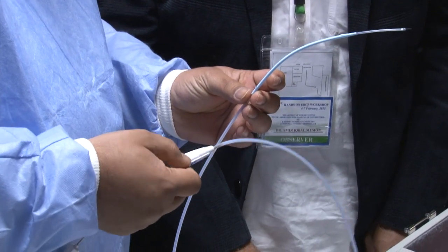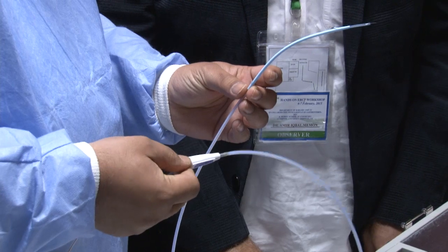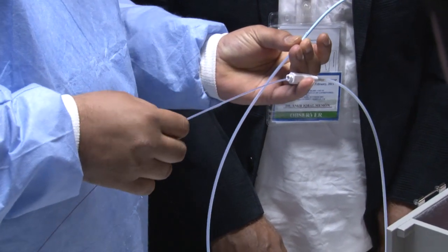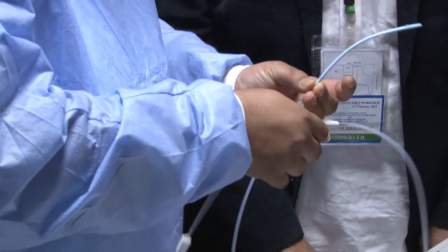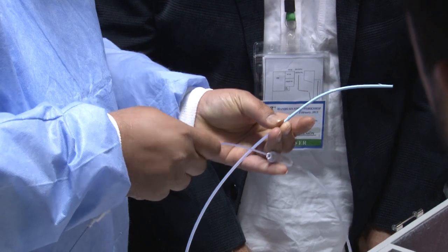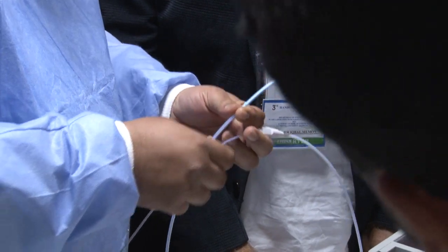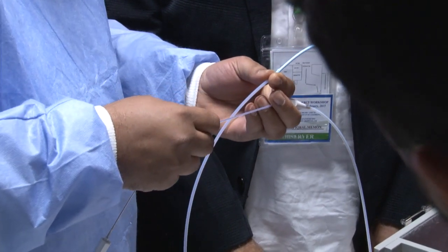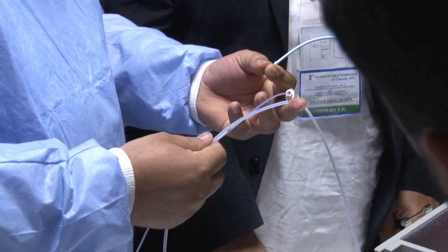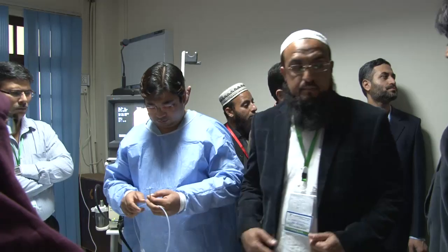But more often than not, I've spoken to a lot of people internationally also about this point. This is something that's close to my heart. And you know, you have to do a good sphincterotomy. There is no such thing as half a sphincterotomy. You have to do a good sphincterotomy, and then you attempt removal of stone. You fail. That's when you go to sphincteroplasty.